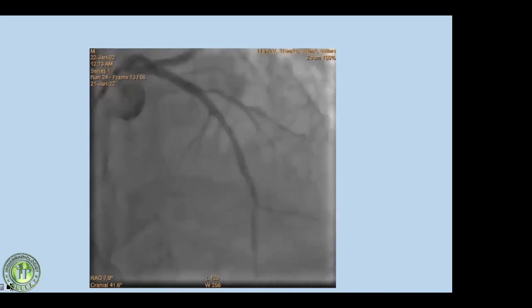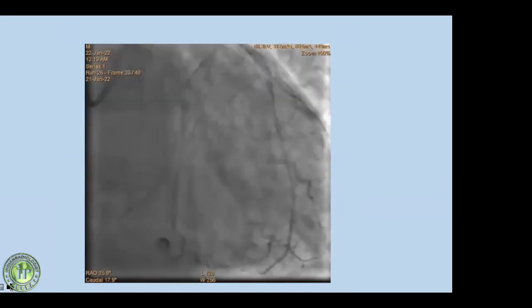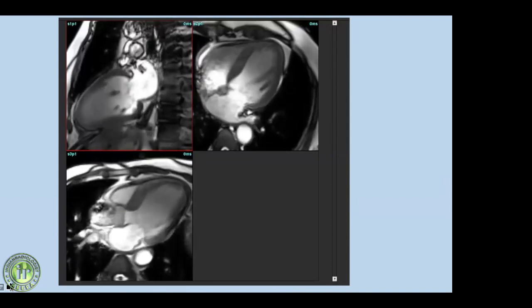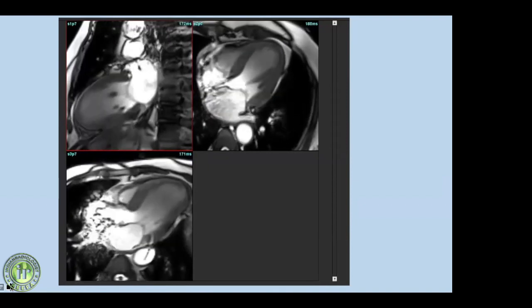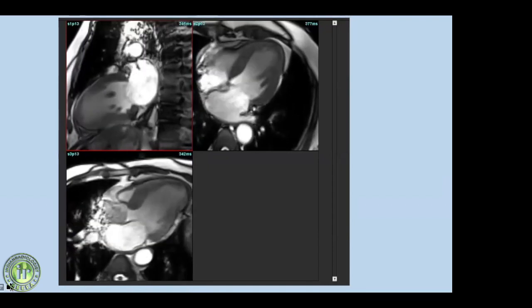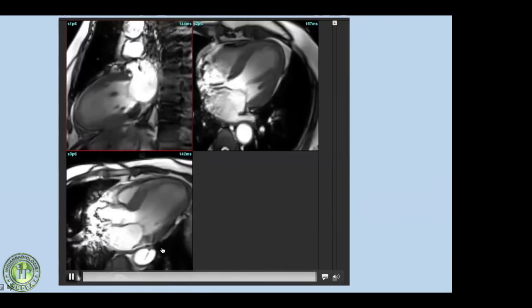Complete opacification of the mid and distal LAD was seen. With angiography alone, anyone would say it is a very positive result and the patient's clinical outcome should be very good. However, cardiac MRI was performed on day five after stenting, before discharge, to prognosticate the patient. These are two-chamber, four-chamber, and three-chamber cine images.